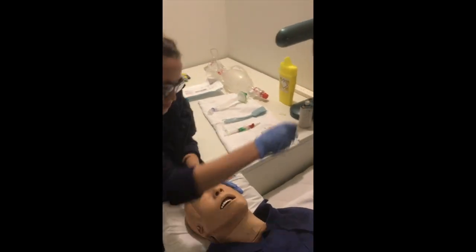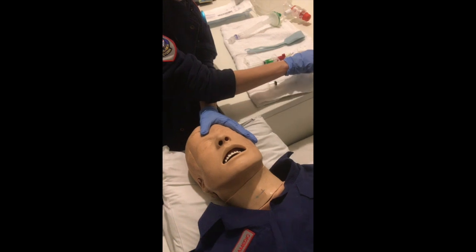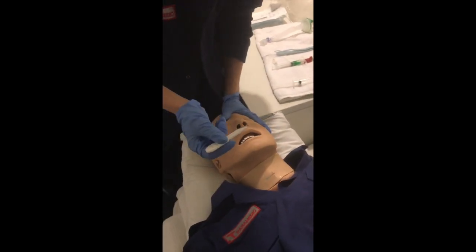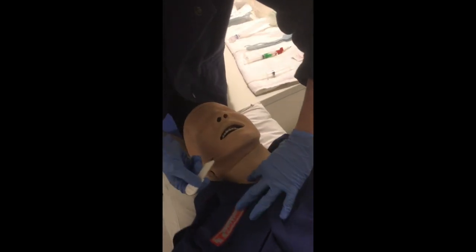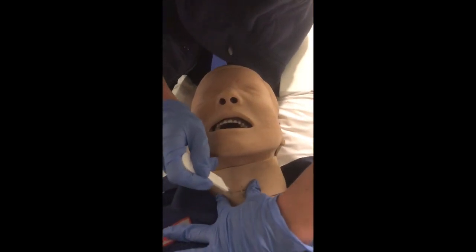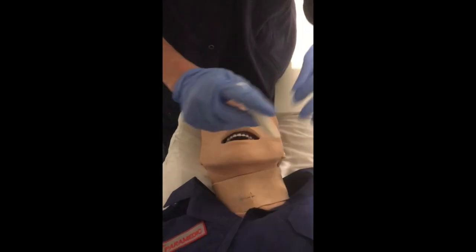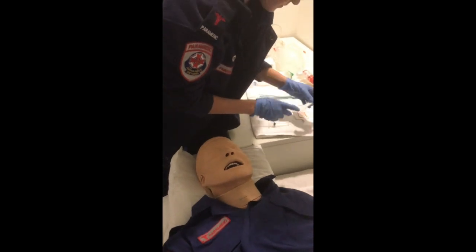So we've swabbed our area. We want to make sure that everything we do skill-wise is being done with our dominant hand. Our non-dominant hand, in this case my left hand, is going to stabilise. We're going to do our incision. It's a 1 centimetre vertical incision to 2 to 3 millimetre depth, whilst maintaining traction with your other fingers.